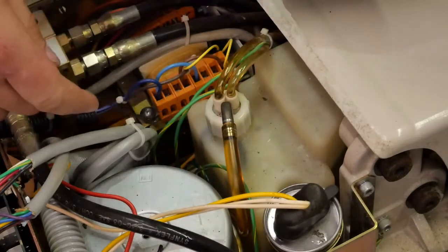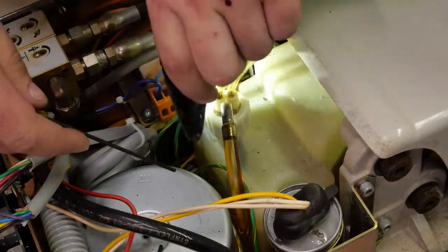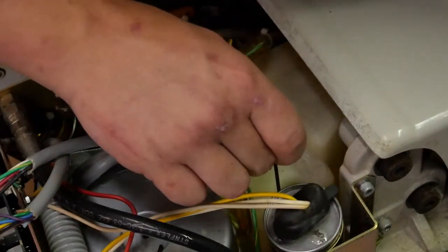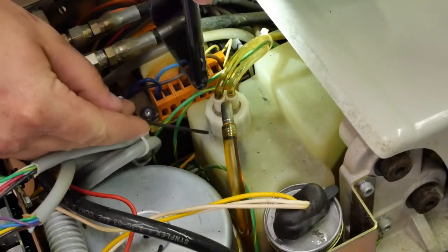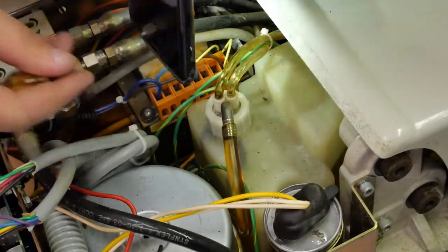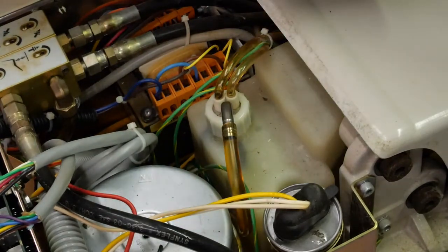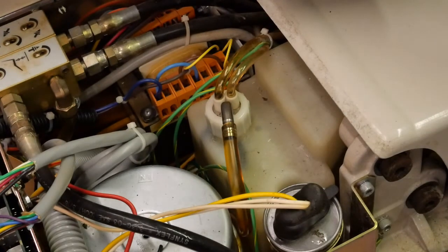Here we have our hydraulic fluid reservoir for our chair. The way you check the fluid is by putting a light right behind it, and then you can see where the line of your fluid is. As long as it's about a half inch from the top, you're good. And that is with the chair base in the lowest position and the chair back also in the lowest position, giving you the most amount of fluid in your reservoir.